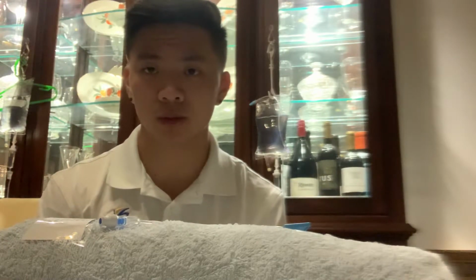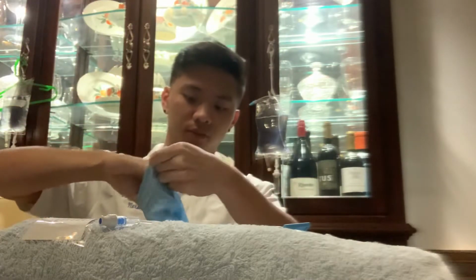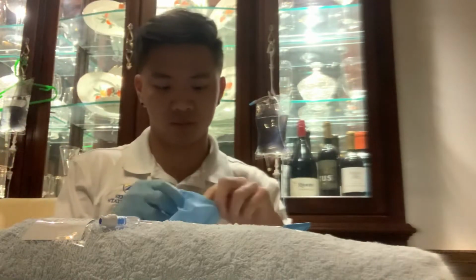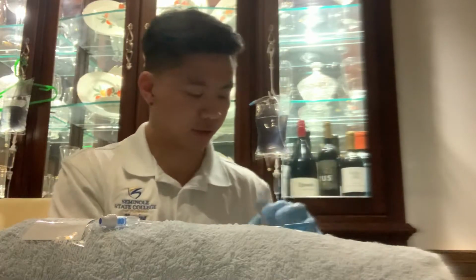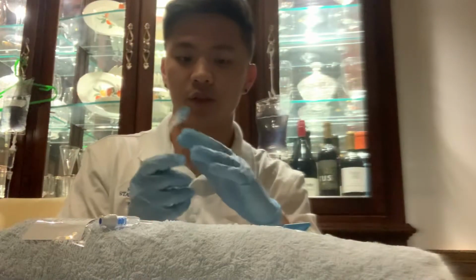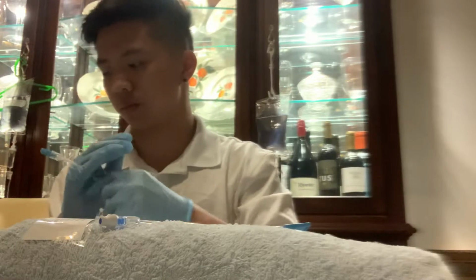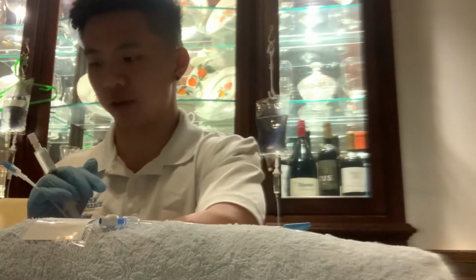After there's no more air bubbles, I'm going to go ahead and perform proper hand hygiene. I'm gonna go ahead and put on my gloves. And I'm gonna make sure I have my end of the tubing, saline flush, and the alcohol pad.